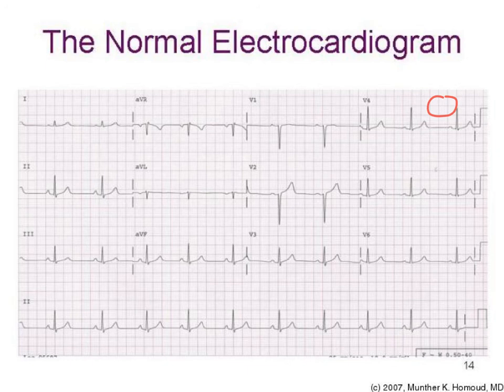The more you familiarize yourself with what a normal ECG pattern is supposed to look like, the more you will be able to identify abnormal electrical activity of the heart based on the change from what normal looks like.